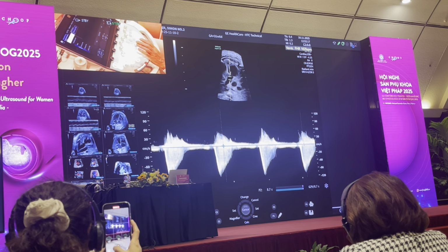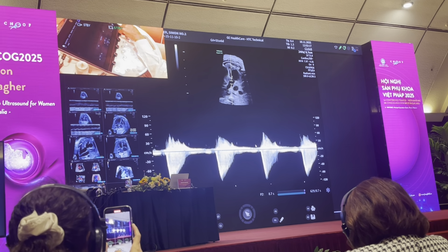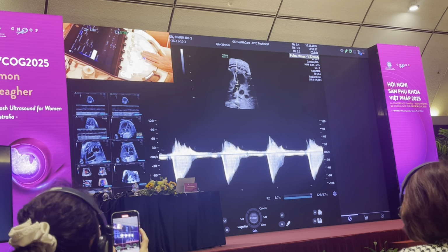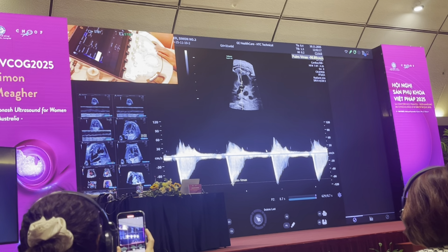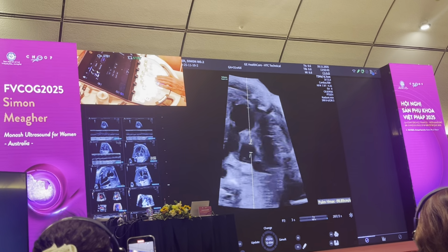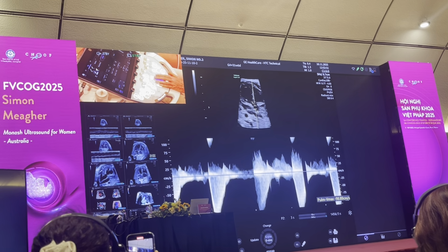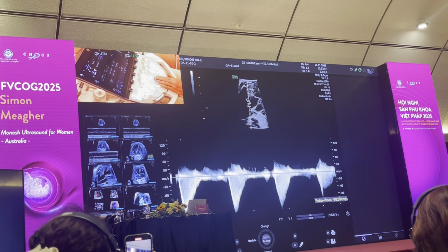So the velocities of this baby are in the upper range of normal. So we do a Z-score, generic max systolic velocity for a pulmonary Vmax. If I look at the pulmonary Vmax velocity, it's just at the upper range of normal, so 98 centimeters. And so this baby's velocities are normal, I'm not worried. And now I'm going to compare, and you can compare one to the other directly.